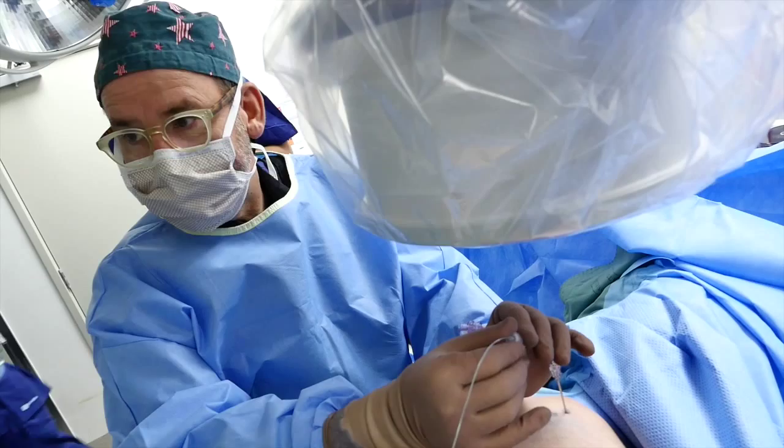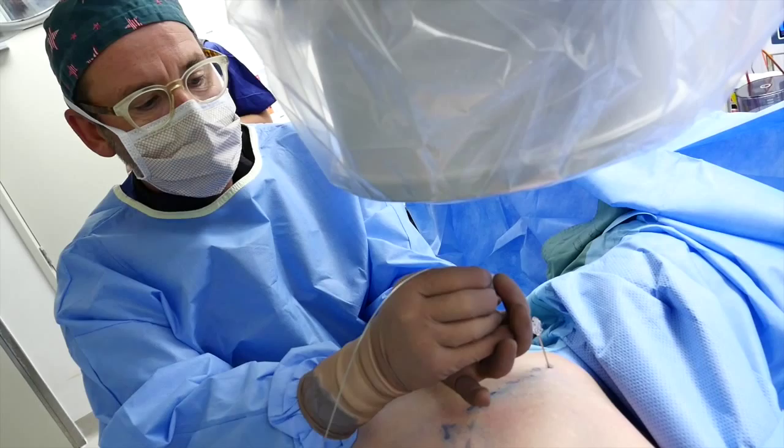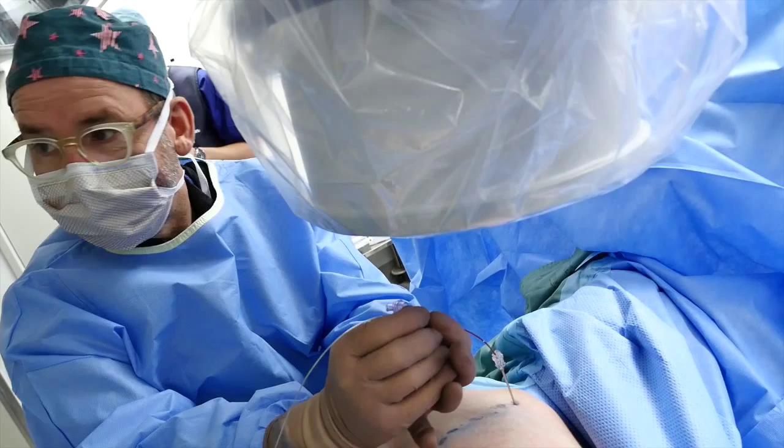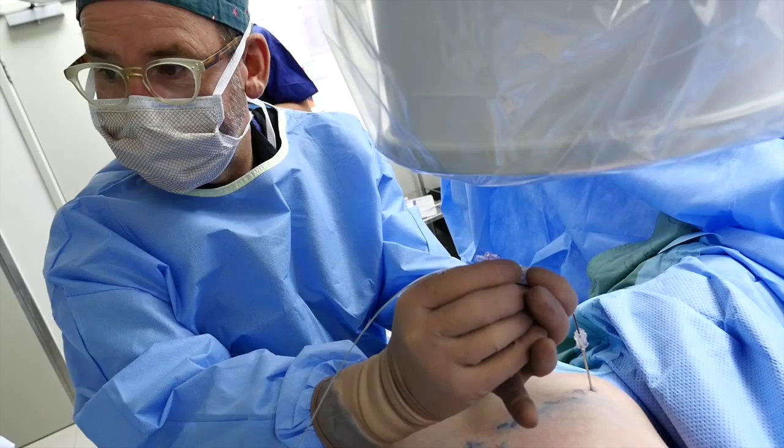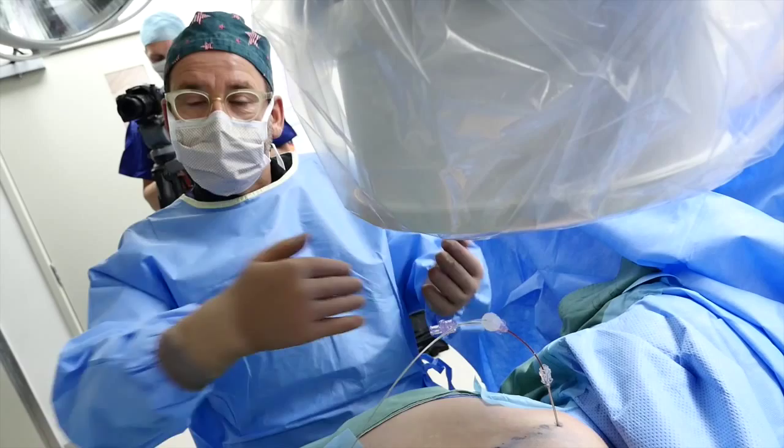The next step is I'm going to unscrew the top of the sheath and pull the sheath back over the lead. Here it comes back and I'm just tapping on the lead — the lead's popped out a bit more in the foramen and I'm very happy with that. The lead is sitting just out through the foramen beautifully and the sheath has come back across.